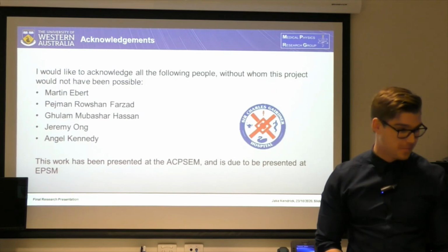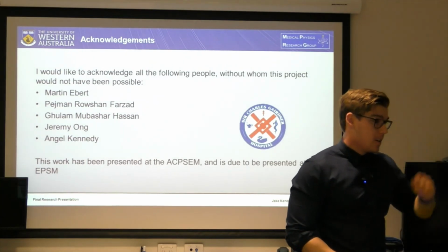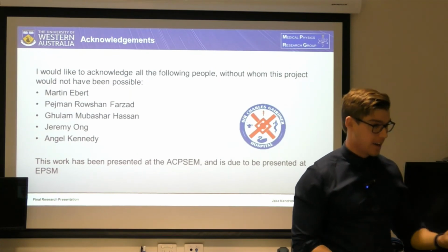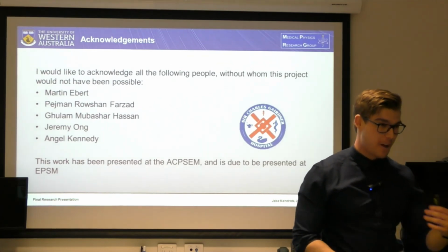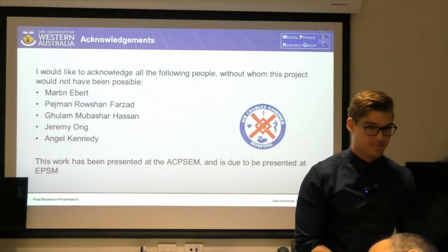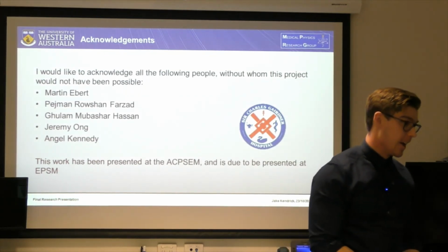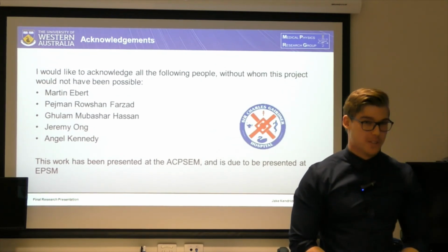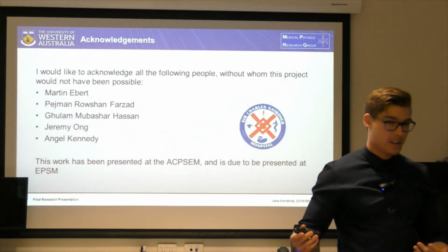Any other questions? How long did it take just to apply the model to an unseen scan? To an unseen case, because it took way longer when I was actually calculating the metrics, because the way Colab works is I had to manually load the model every single time, so it was a huge pain. But for one slice, you're looking at a thousandth of a second. It's basically instant. So if you put in a whole patient image, you could probably segment that in less than a second, or maybe just over a second. So that's the whole advantage of this, basically. We're able to do it quickly.